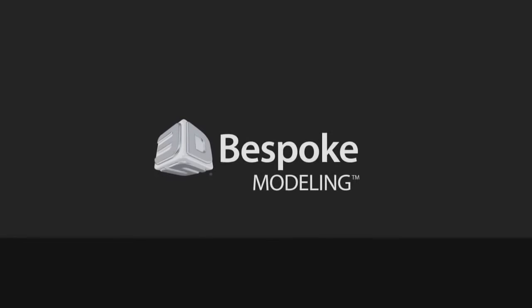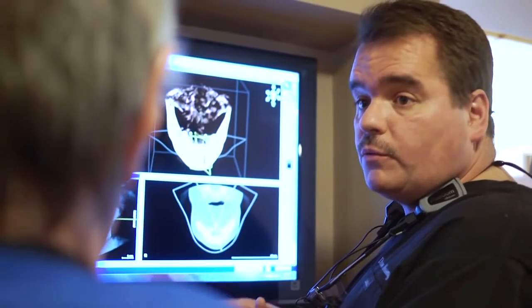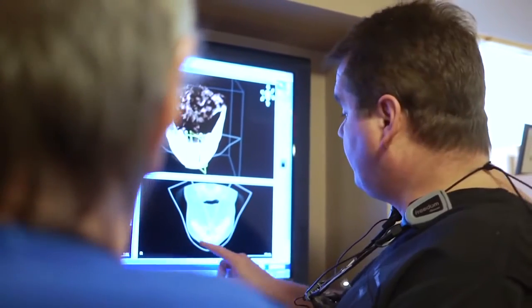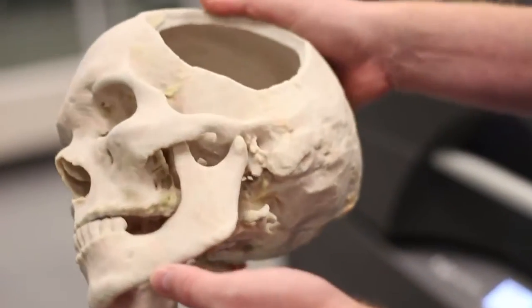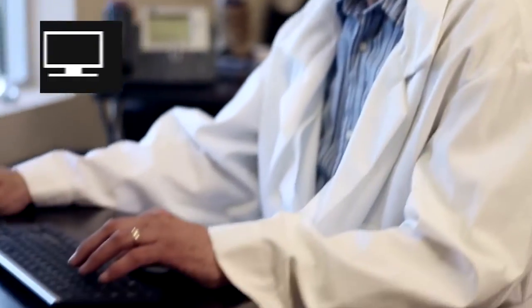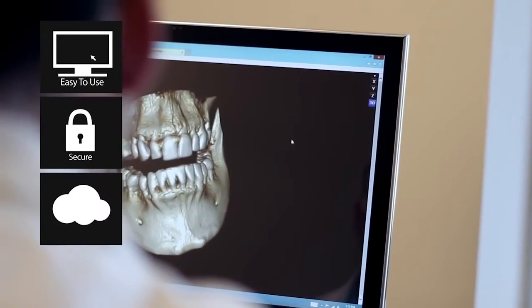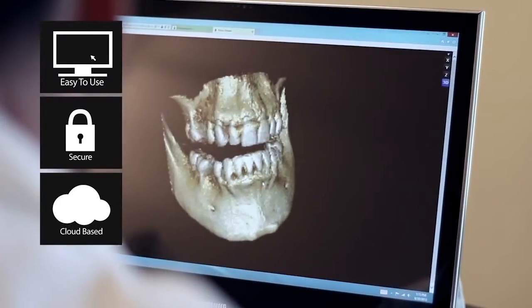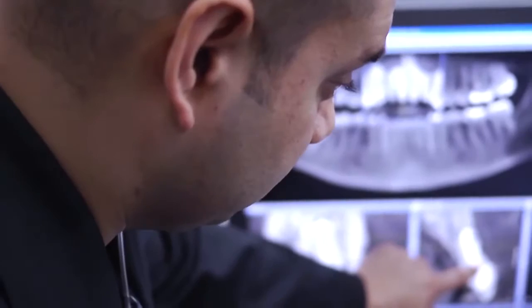Introducing Bespoke Medical Modeling, a new cloud-based application that converts DICOM data from a CT or MRI scan into a 3D physical model in just a few clicks. This easy-to-use, secure, cloud-based service makes it simple for you to create stunning models in minutes, and it's low cost, with subscriptions starting at just $30 a month.